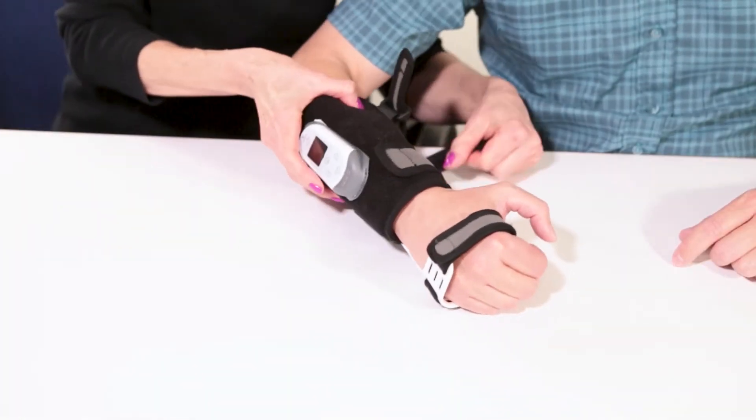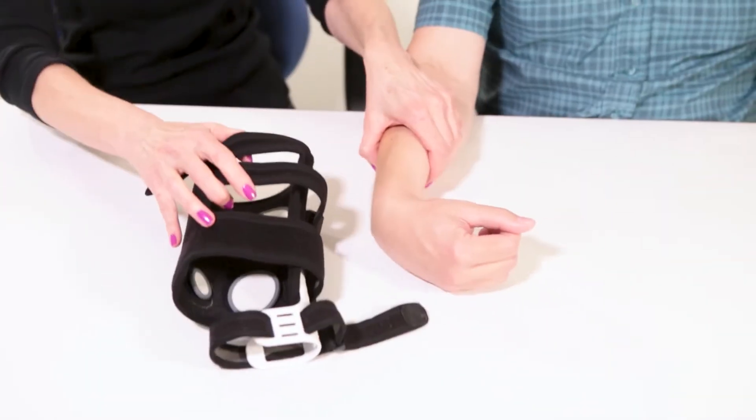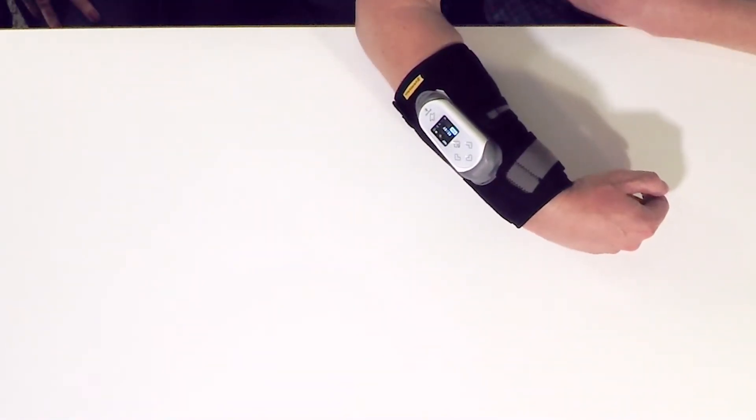For some people, using the wrist support may be desired. For example, if significant flexor spasticity is observed, or if the re-grasp causes too much wrist flexion when activating hand grasp.